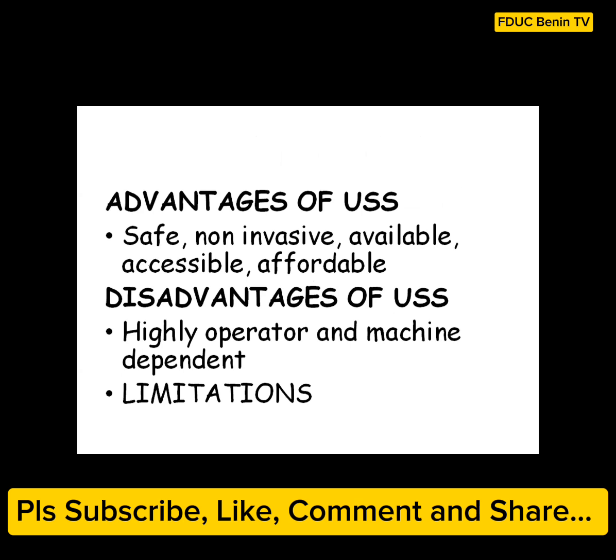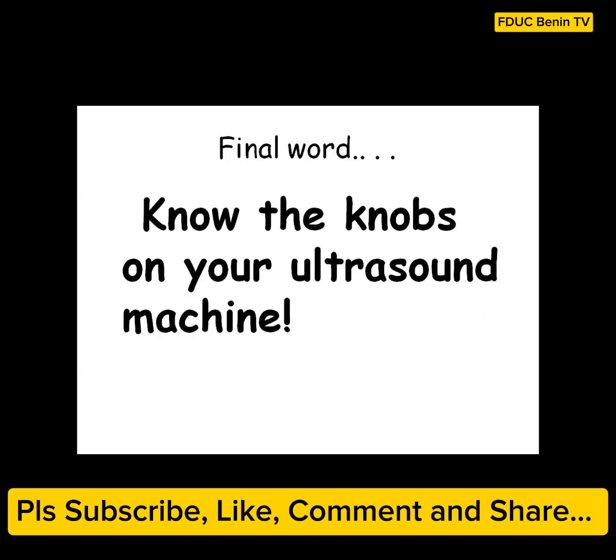So thank you very much. Before I end, I want to say that ultrasound is very interesting. The advantages include that it's safe, not invasive, easily available, accessible, and affordable. However, one of the disadvantages is that it's highly operator dependent and machine dependent. But I'm sure that at the end of this training, we will see the benefits of ultrasonography and use it for the best of our patients. Finally, I want to say that you should know the knobs of your machine as much as you can.